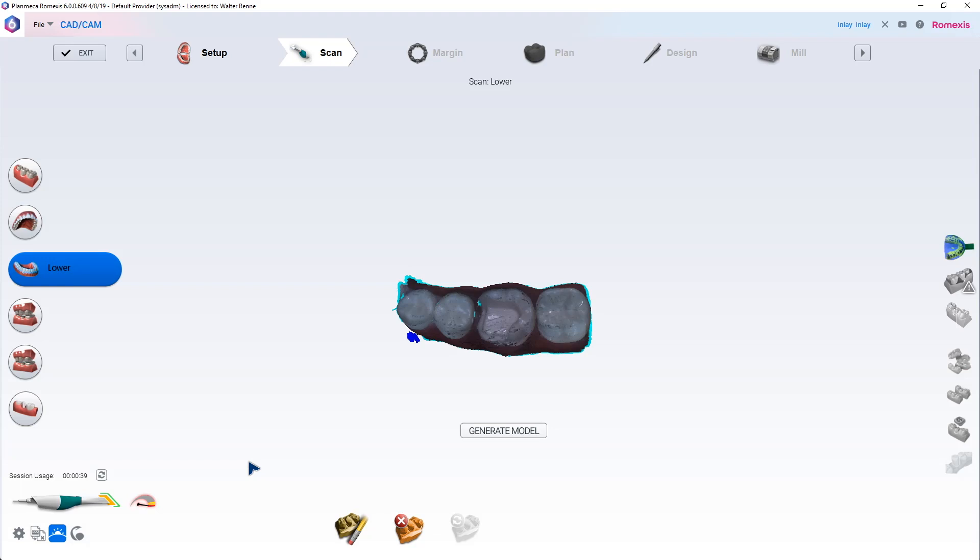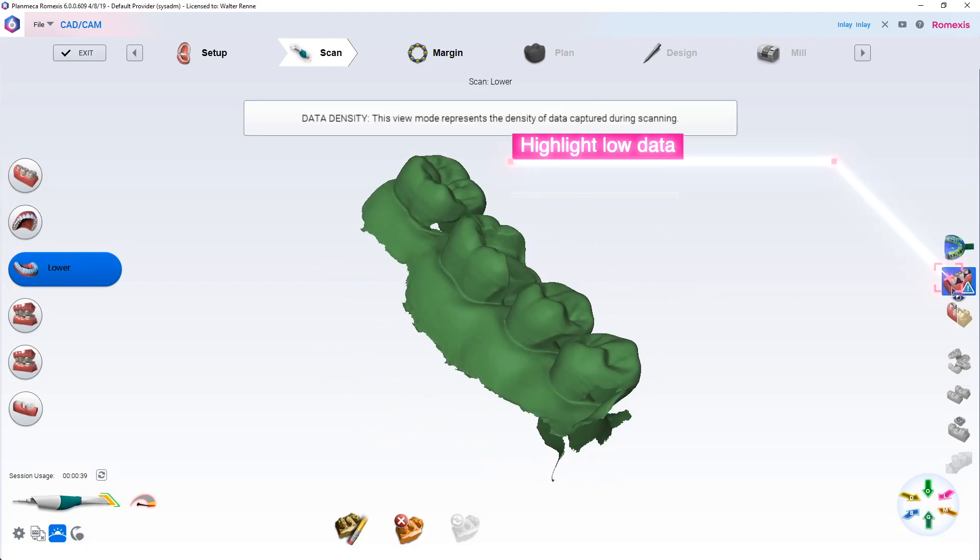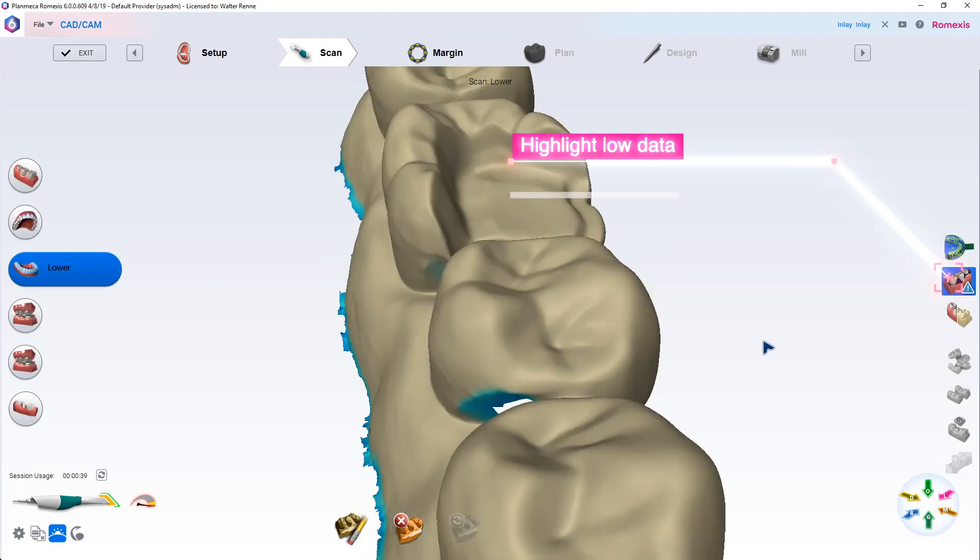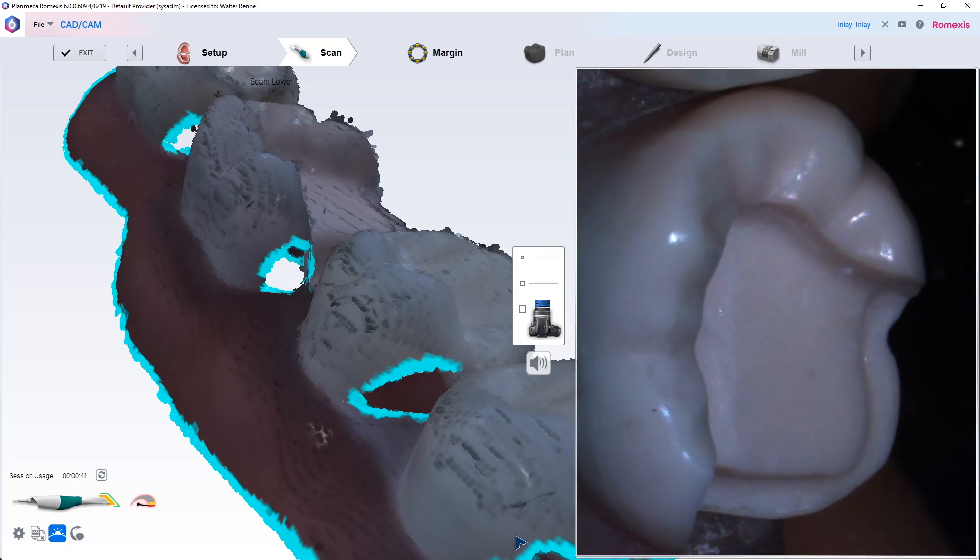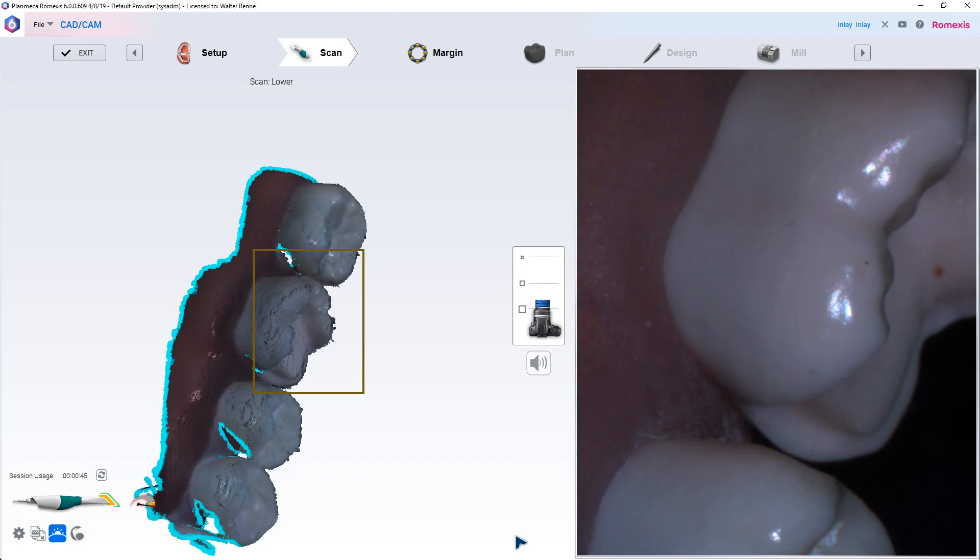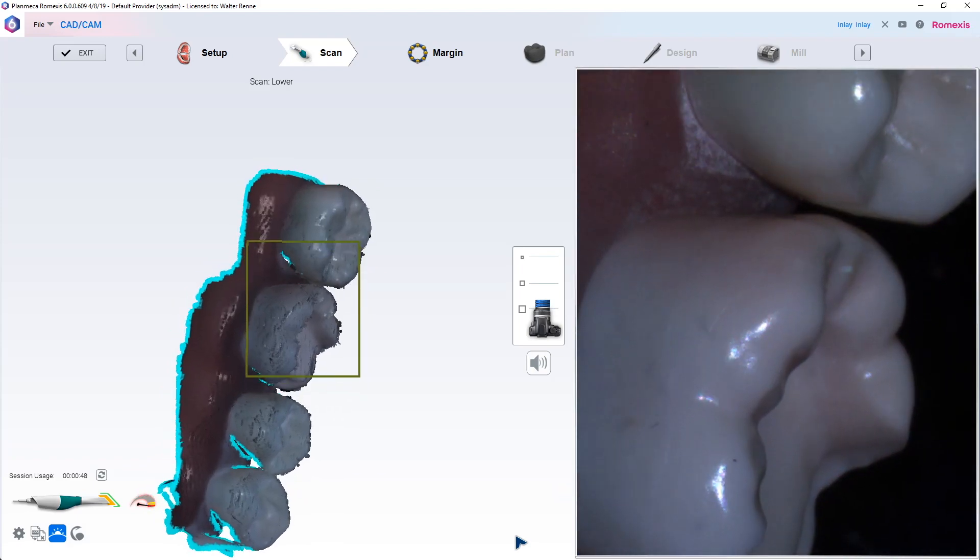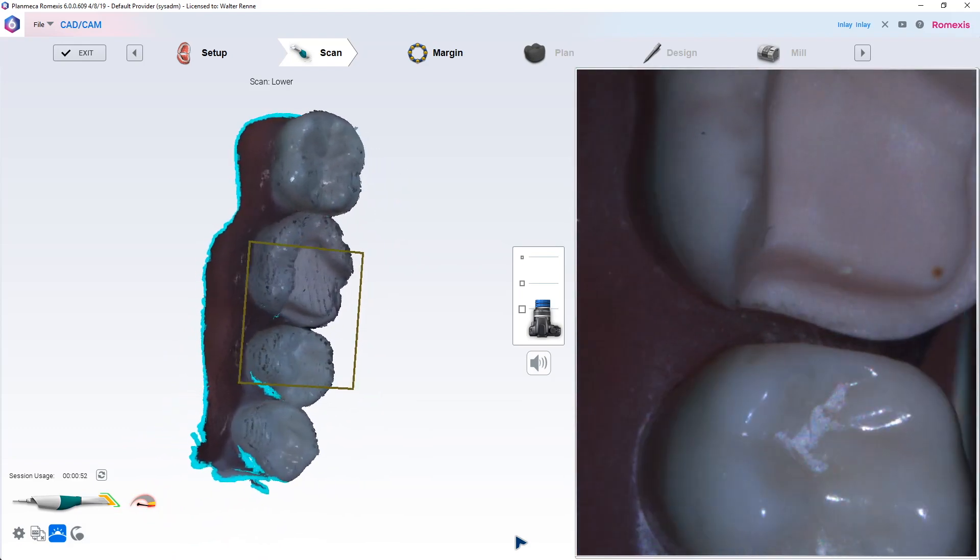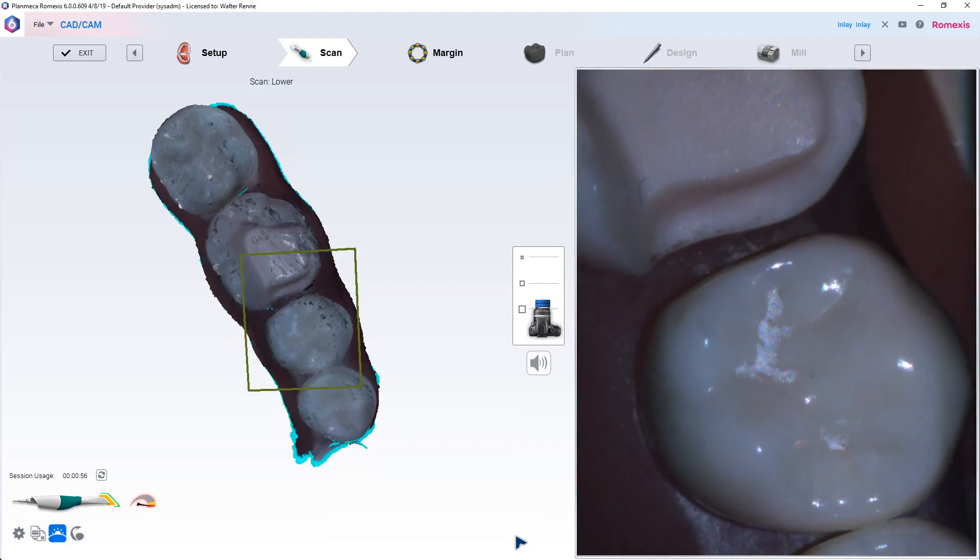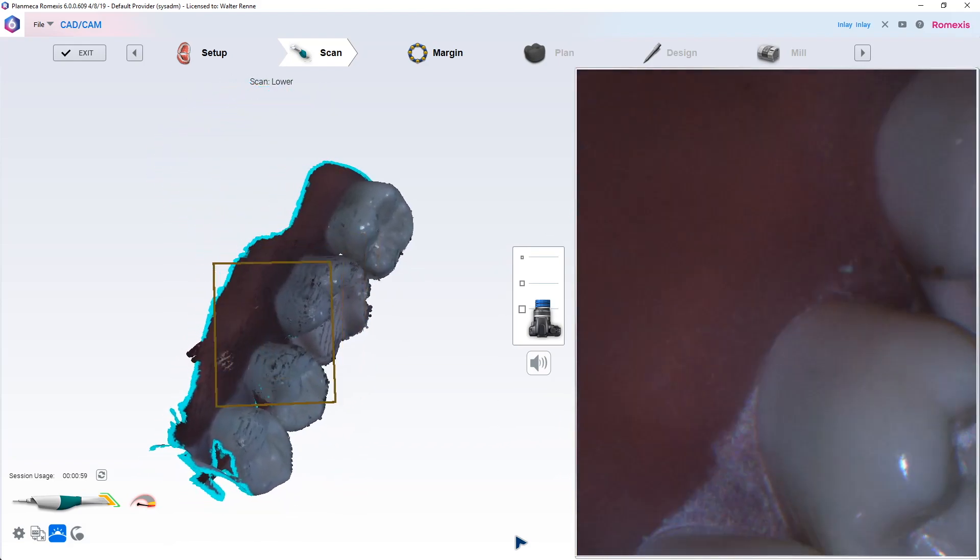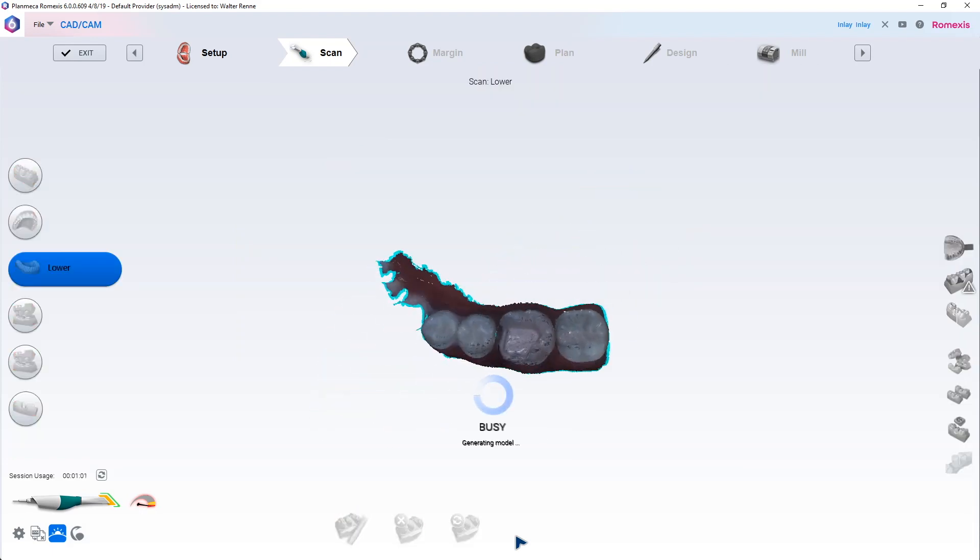Alright, let's take a look at the model and see if there's any areas that I missed. Before you generate the model, you could look, or you could generate it and then hit the highlight low data area and look for bluish areas. So you can see that blue area. It's not that critical of a spot, but I'm going to go ahead back and just fill it in. Here we go, trying to rotate that camera kind of underneath the height of contour of that mesial to sneak it into that crevice there. Those are always tricky areas to scan on any camera, right where that box corner is.